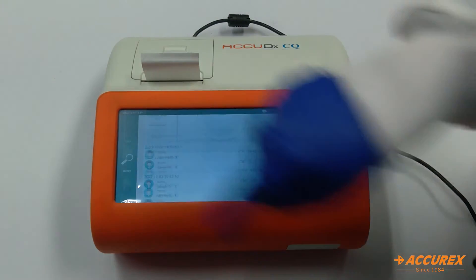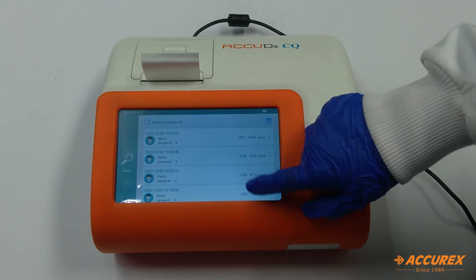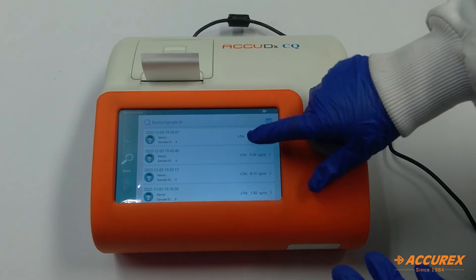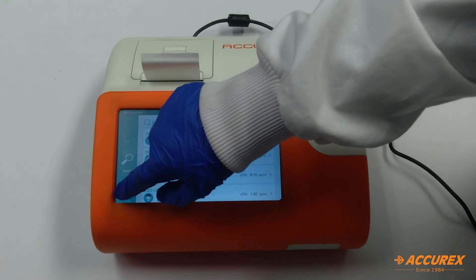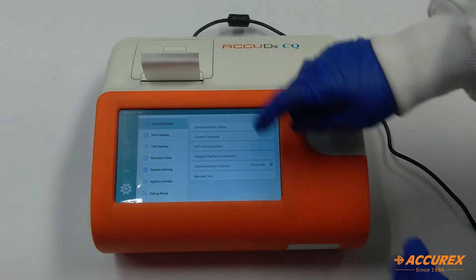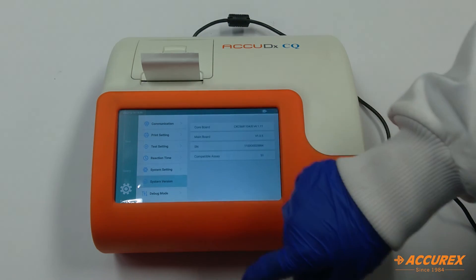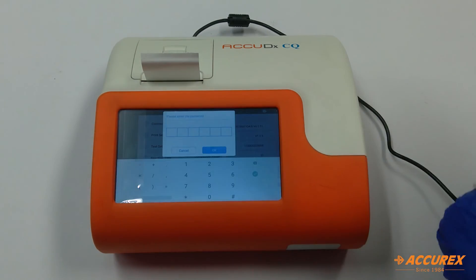The second option is query, where you can see all tests that have been performed and get records of previous tests. The last option is settings, from where you can change communication, print setting, test setting, reaction time, and system setting. You can also see the system version and debug mode.